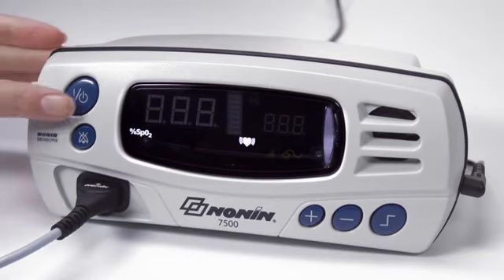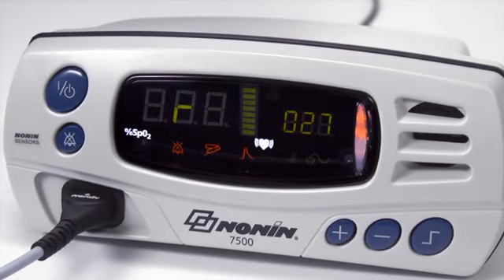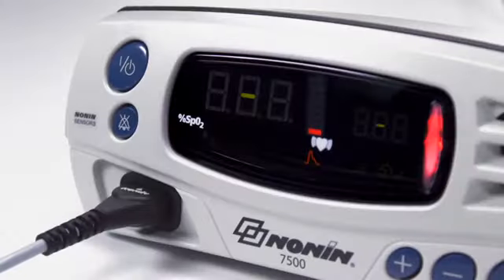Press the on-off button to start the unit. The oximeter will run through a power-up initialization as it turns on. Watch to ensure all the LED elements and information appear as shown here. If any LED elements do not appear or if any of the displays do not appear as expected, remove the unit from use and return for service or repair.